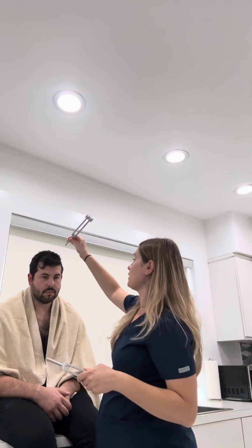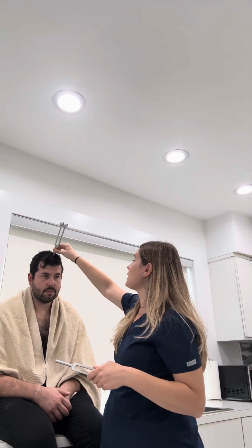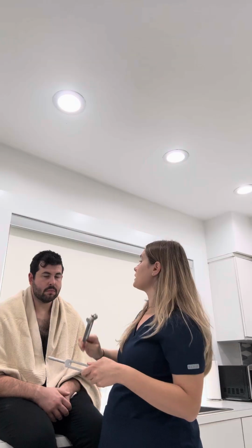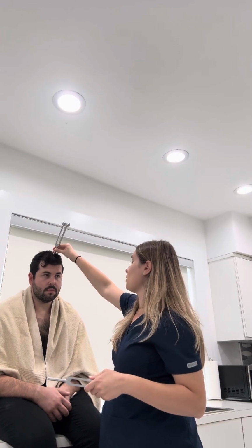Starting off with the Weber test, I'm going to be striking the tuning fork and placing it on your midline. Please tell me if sounds are equal on both sides. Yes. Good. Okay. No lateralization noted.